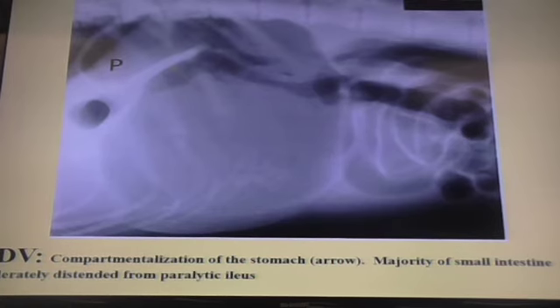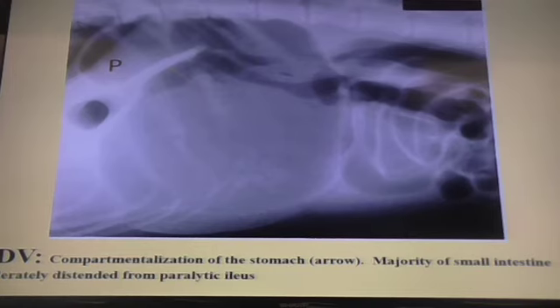So a lot of the readings say that it looks like a bookshelf. Is that bookshelf appearance? I don't know what it is. Yeah, so I'm trying to understand it. Okay, can you just show me where you found that? Well, that's what I was mainly just asking.